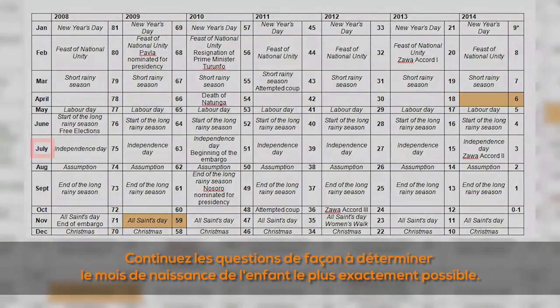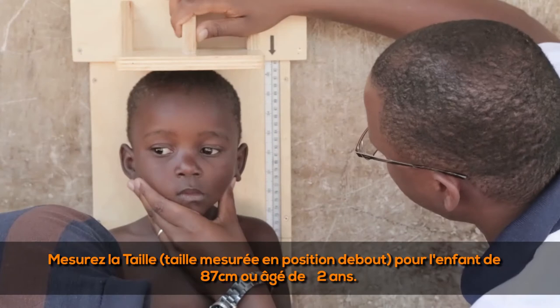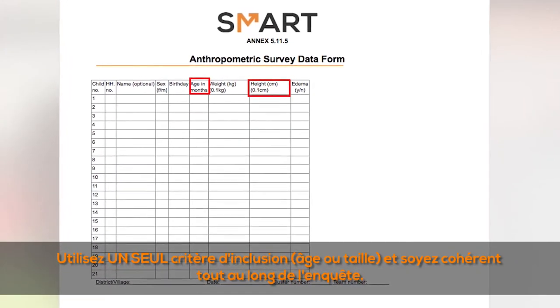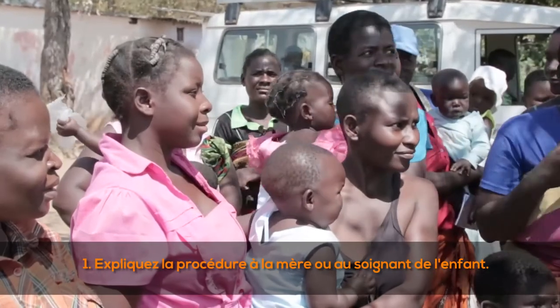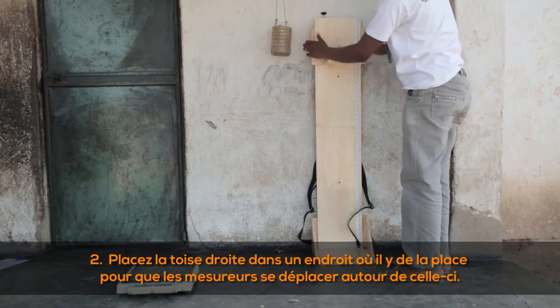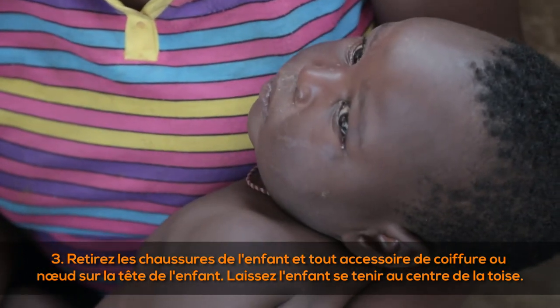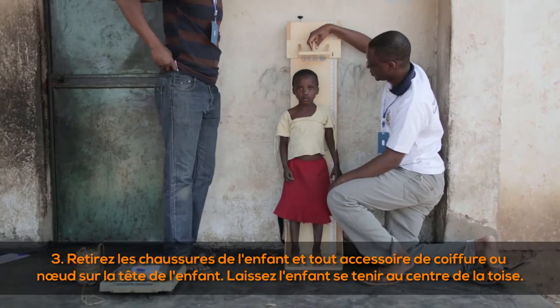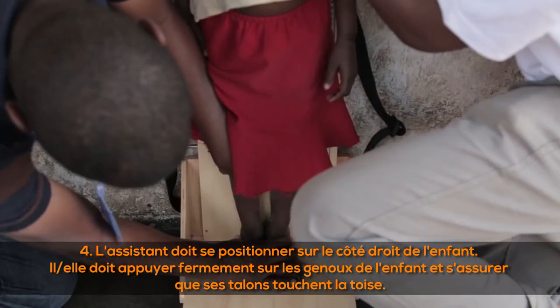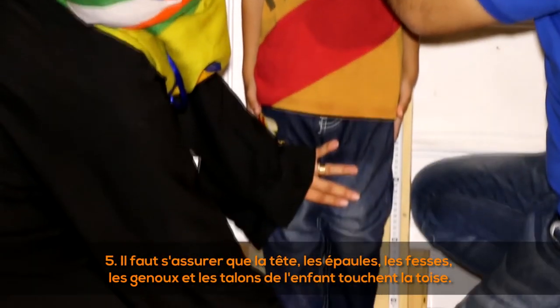Measure height when the child is more than or equal to two years of age or more than or equal to 87 centimeters. Use one inclusion criteria and be consistent throughout the survey. (1) Explain the procedure to the child's mother or caregiver. (2) Place the height board upright with room for the measurers around it. (3) Remove the child's shoes and any hair ornament, and let the child stand in the middle of the height board. (4) The assistant, positioned on the right-hand side, firmly presses the child's knees and ensures their heels are touching the board. (5) Ensure the child's head, shoulders, buttocks, knees, and heels all touch the board.